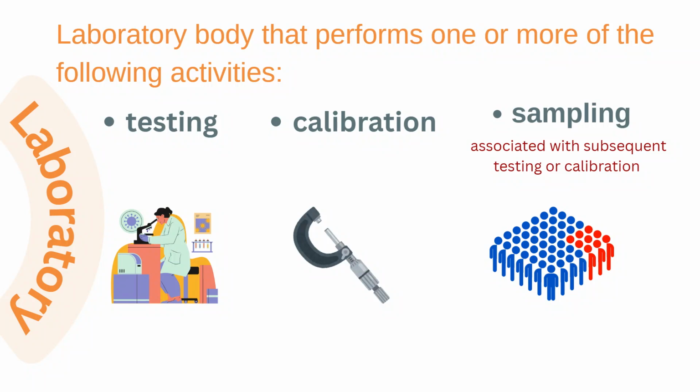In India, we follow ISO 17025, but we get a certification as NABL, the National Accreditation Board for Laboratories, who will come and verify whether we are following ISO 17025. If they're satisfied, then they will give us NABL certification. Only with NABL certification can laboratories go to hospitals for testing and calibration. Especially if it is an NABH hospital, you should have an NABL certified laboratory to calibrate and test their equipment.